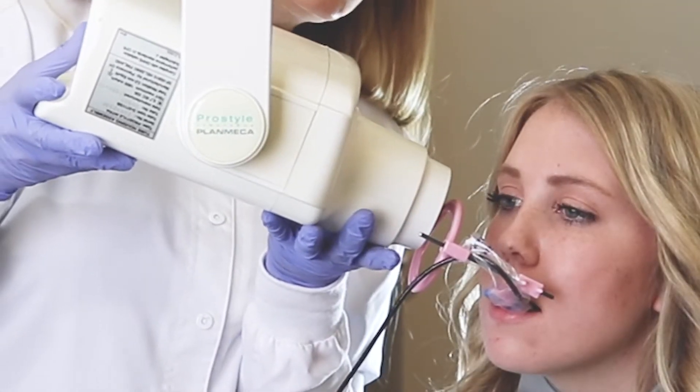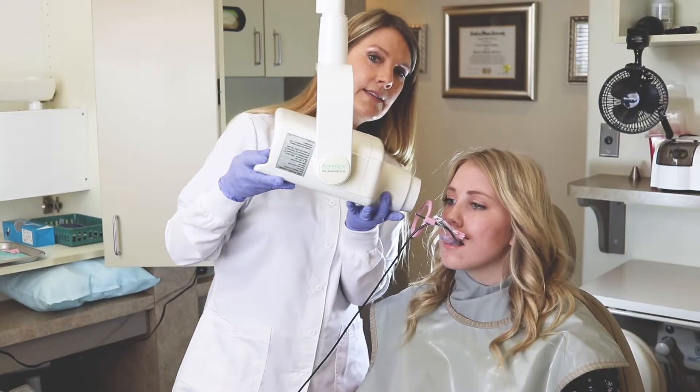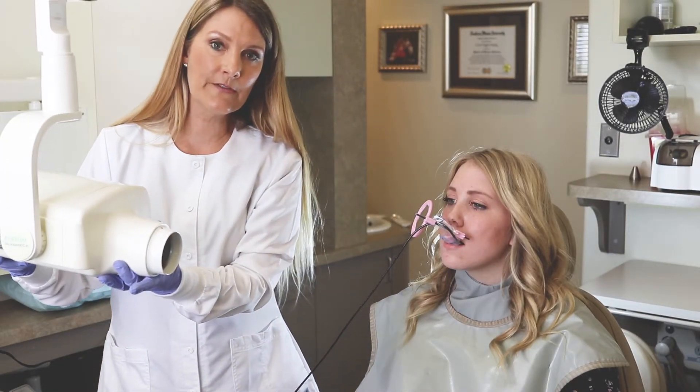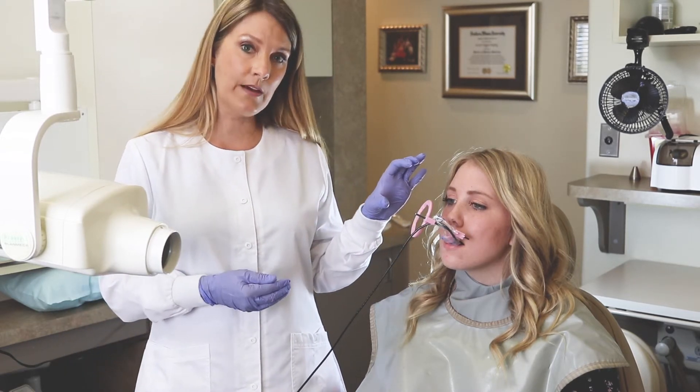— you may actually need to raise up the level of your x-ray head. X-ray heads are not standard; they're all a little bit different and may need to be positioned slightly higher so that you can actually catch the apex of the canine.